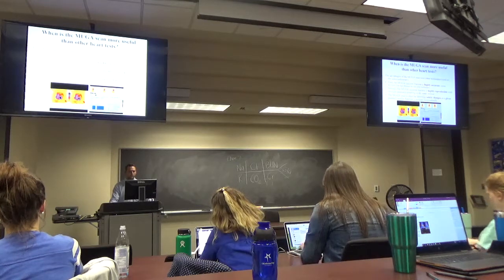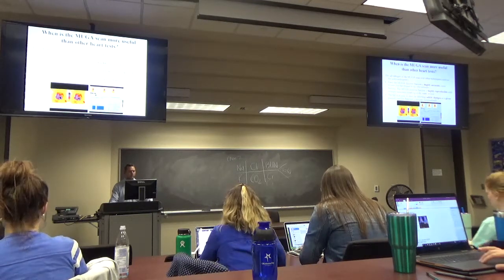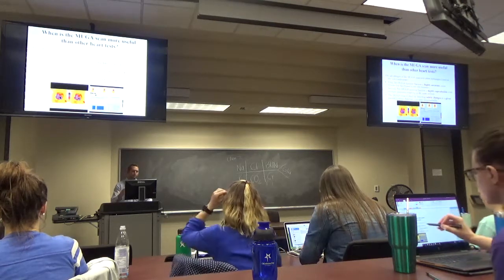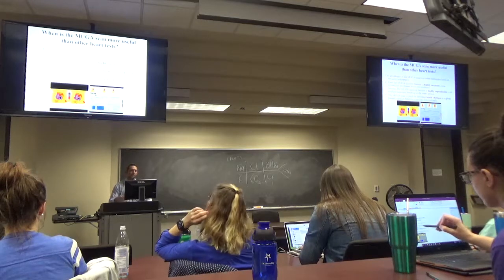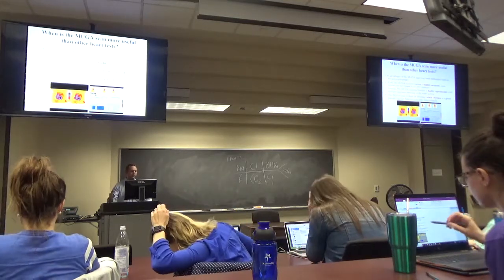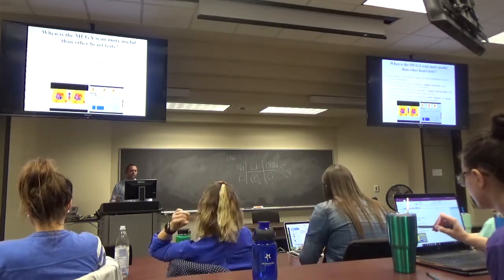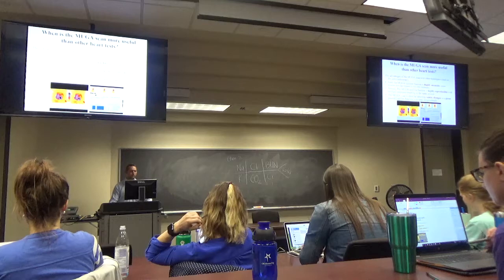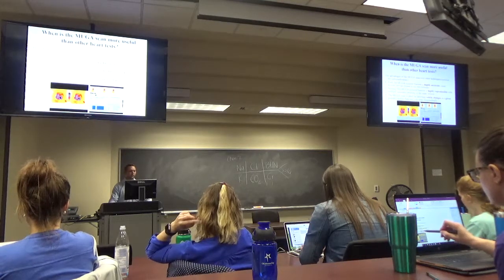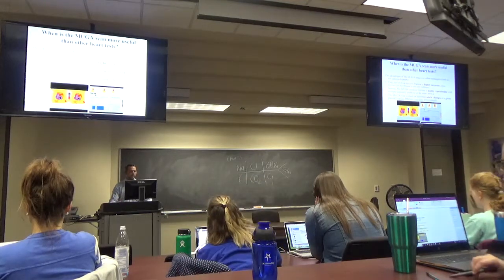So, some of the advantages of this. It's highly accurate for the ejection fraction, like we already talked about. It's reproducible, so you could do this scan and get the same ejection fraction a day from now, 5 days from now, if nothing changes. And if you want to detect subtle changes in someone's cardiac function over time, longitudinally, then it's ideal for it. And I think that's where it really is used today.